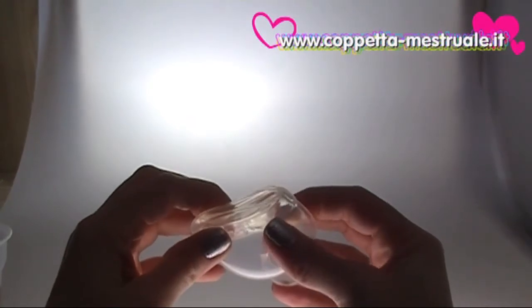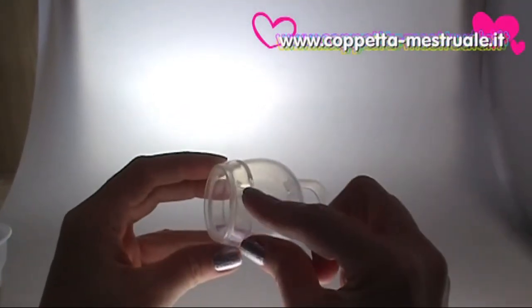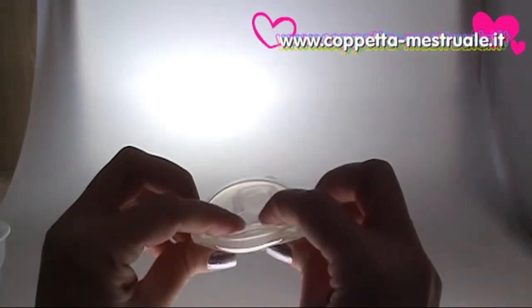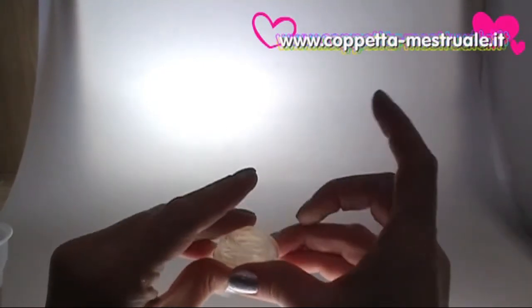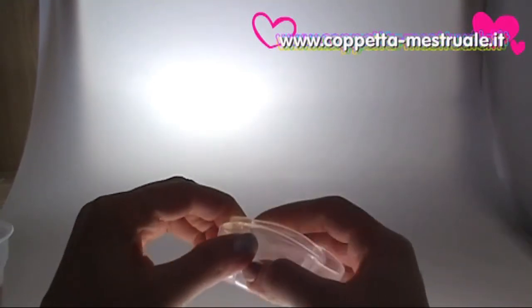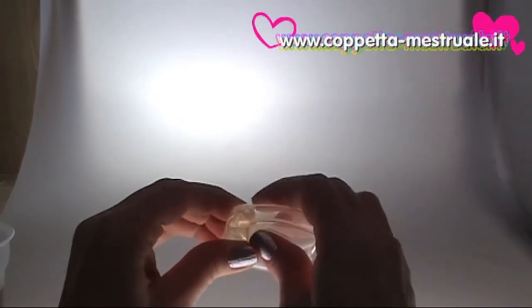The Femicycle is very easy to use. Just close the rim firmly and fold it into a tight U shape at the notch. This will trap some air inside the cup. The trapped air will help the cup pop open when it is inserted into the vagina.